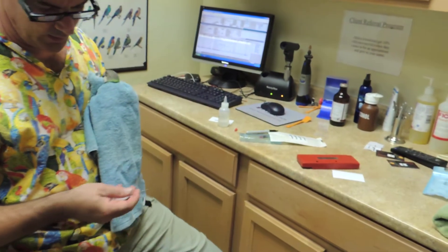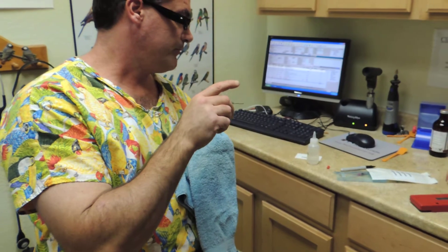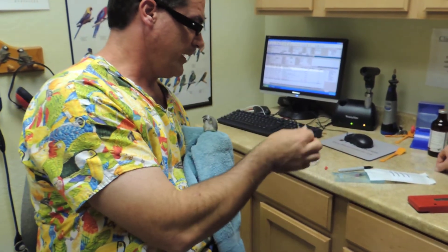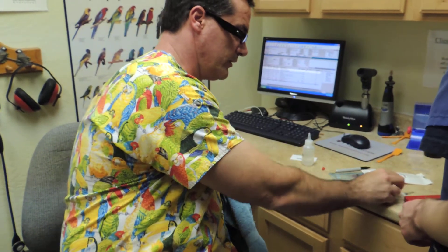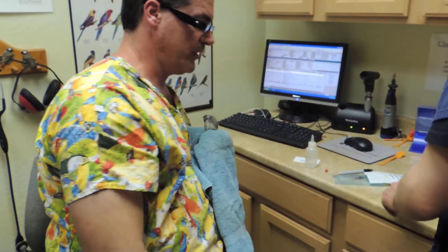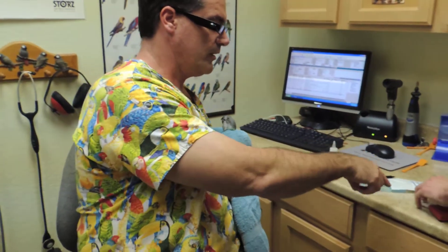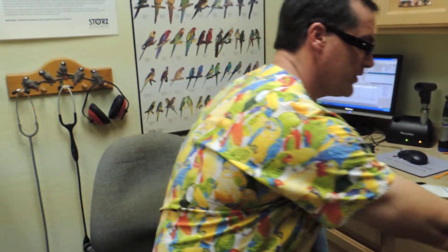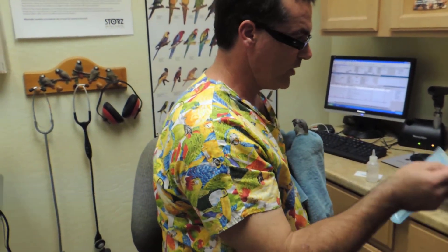Unless you're doing it with a — go ahead and cold sterilize that. Get a new one and we can reload that after it's cold sterilized. Get a new chip. So this is already available. Let me set this up.